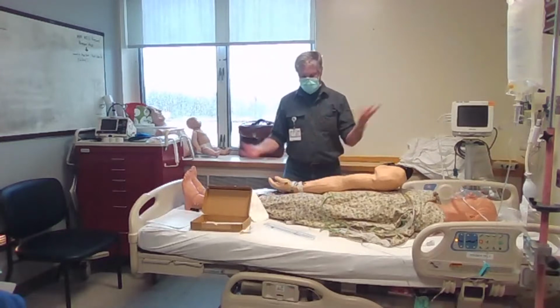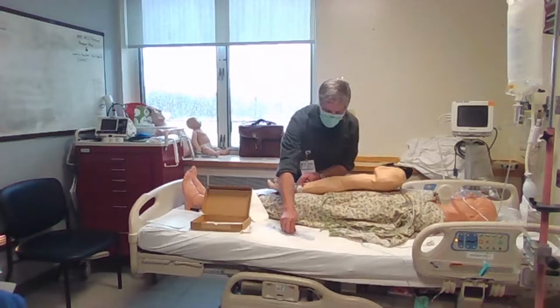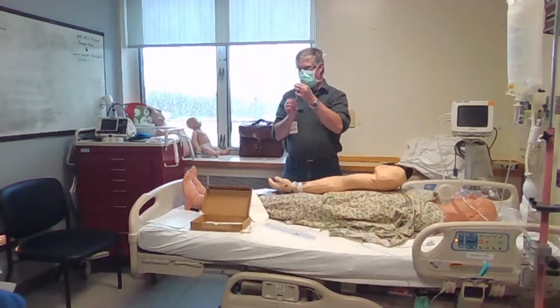Okay, so what I do is I use 2 fingers, I find the radial artery right here. You can feel the boom, boom, boom. Take everything off. I always just give the wire a push through to make sure that it moves smoothly, because it can hang up in the artery.